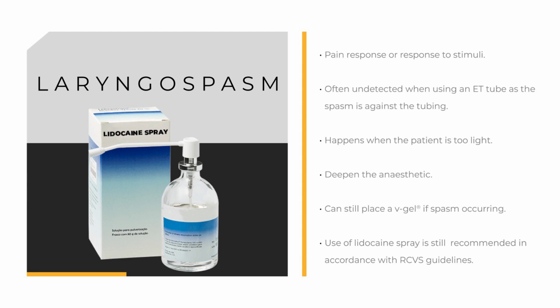If a laryngospasm occurs during your anaesthetic, firstly deepen the anaesthetic immediately. If a V-gel is in place, this can be done with a volatile agent along with the use of IPPV. If a V-gel is not in place, place the V-gel as previously described while simultaneously administering anaesthetic drugs via the IV cannula. Once the V-gel is in place, perform IPPV to deepen the anaesthetic.